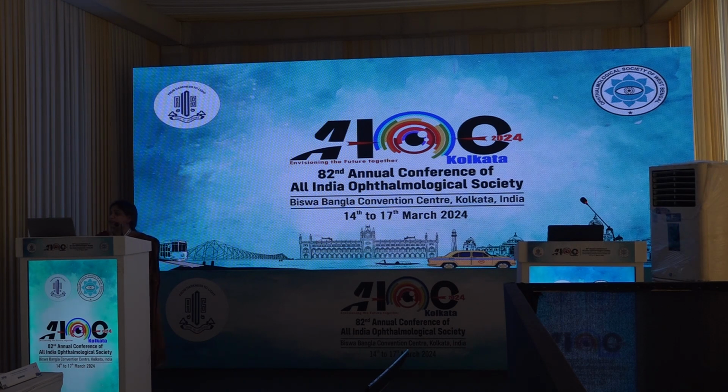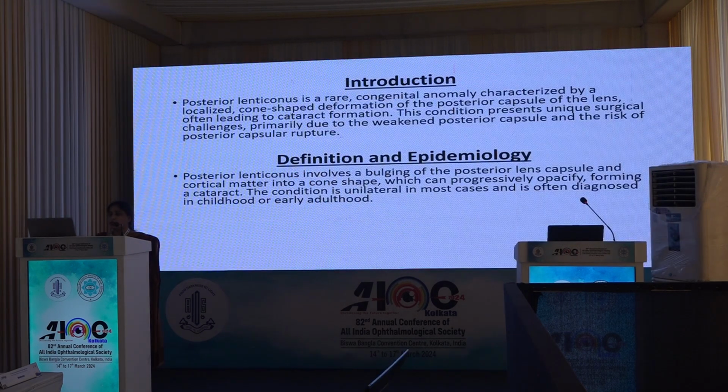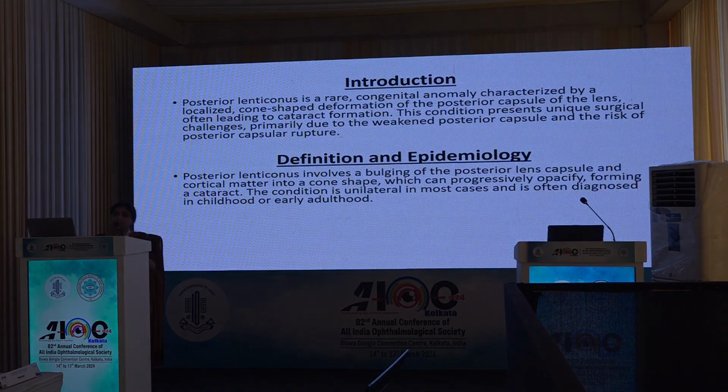So my next topic is cataract surgery in lenticonus. That is posterior lenticonus. So what is posterior lenticonus? The lens is cone shaped on the posterior side. So it is definitely a congenital anomaly.